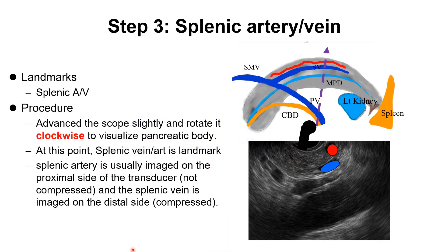Step 3: Splenic artery and vein. Advance the scope slightly, then rotate clockwise, and we can see the pancreatic body and tail area. At this point, the splenic artery and vein are good landmarks. The splenic artery is usually imaged on the proximal side of the transducer and is not easily compressed. The splenic vein is imaged on the distal side and is very easily compressed. Color flow can help identify the splenic artery and vein.